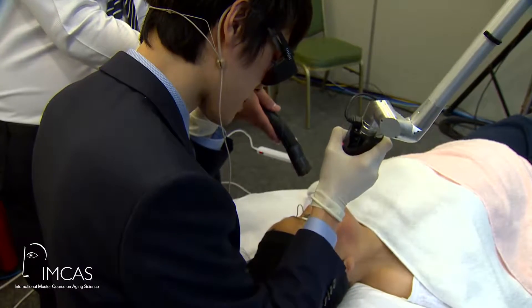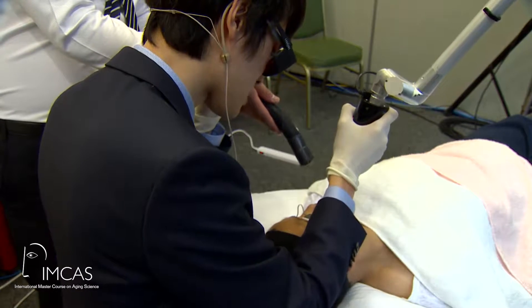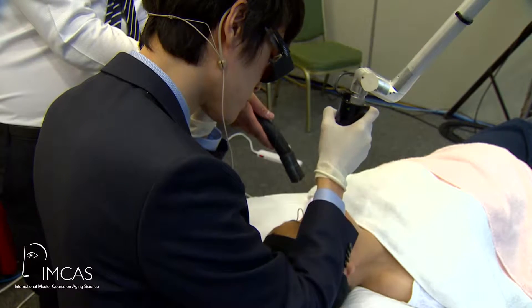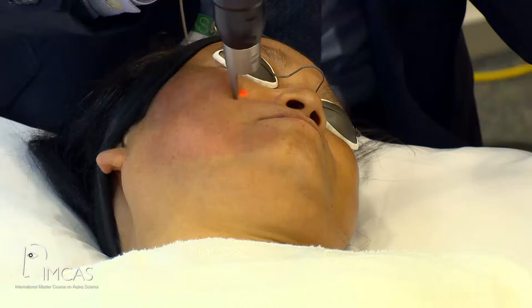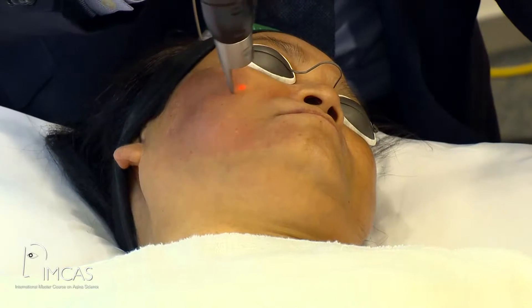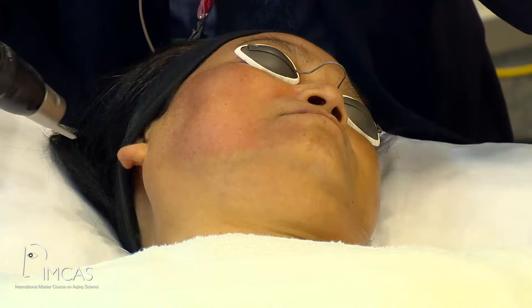I would educate my patient that what she needs is not a once-for-all pigment removal after only one treatment. I would tell her she needs to come for maybe two, three, or even four sessions of treatment, and with each treatment we would remove part of her pigment.